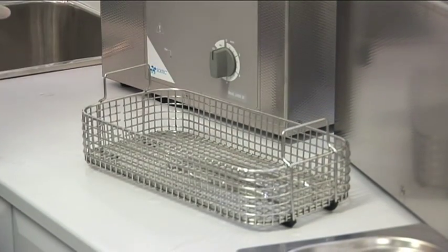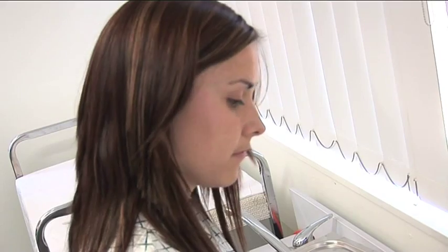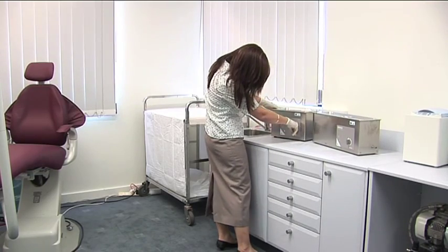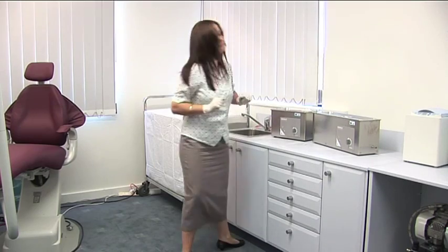A Soltech Sonica ultrasonic cleaner will remove the need for manually cleaning your instruments. This greatly improves your staff time and significantly lowers their occupational health and safety exposure.